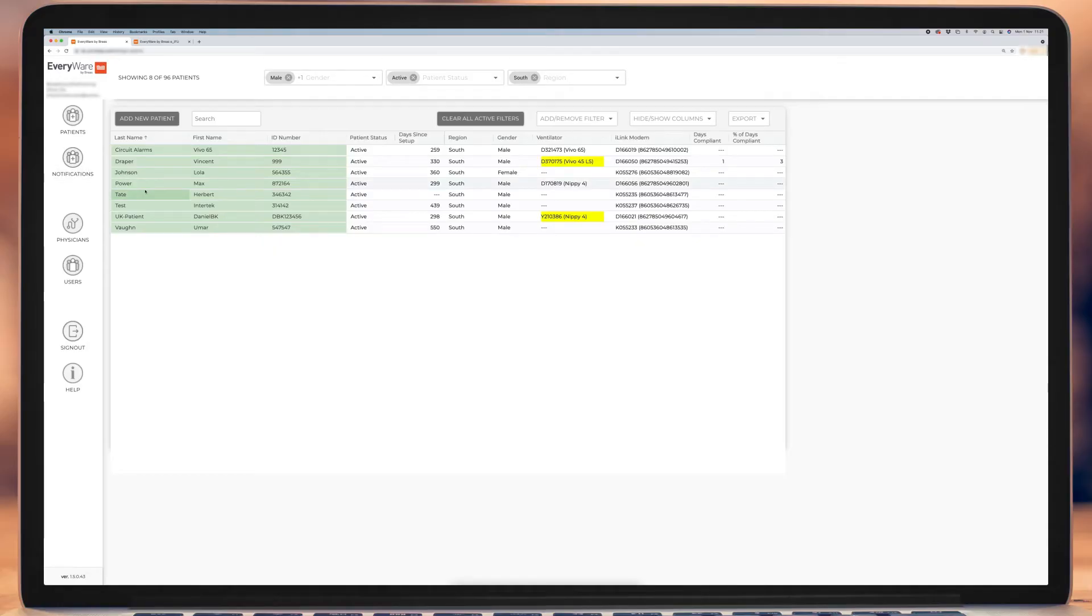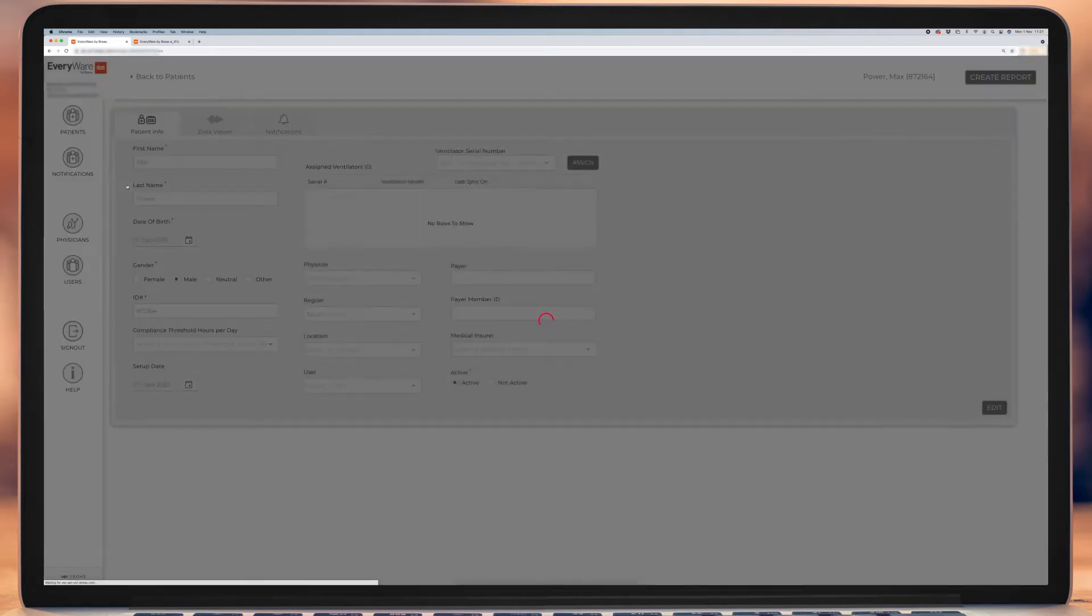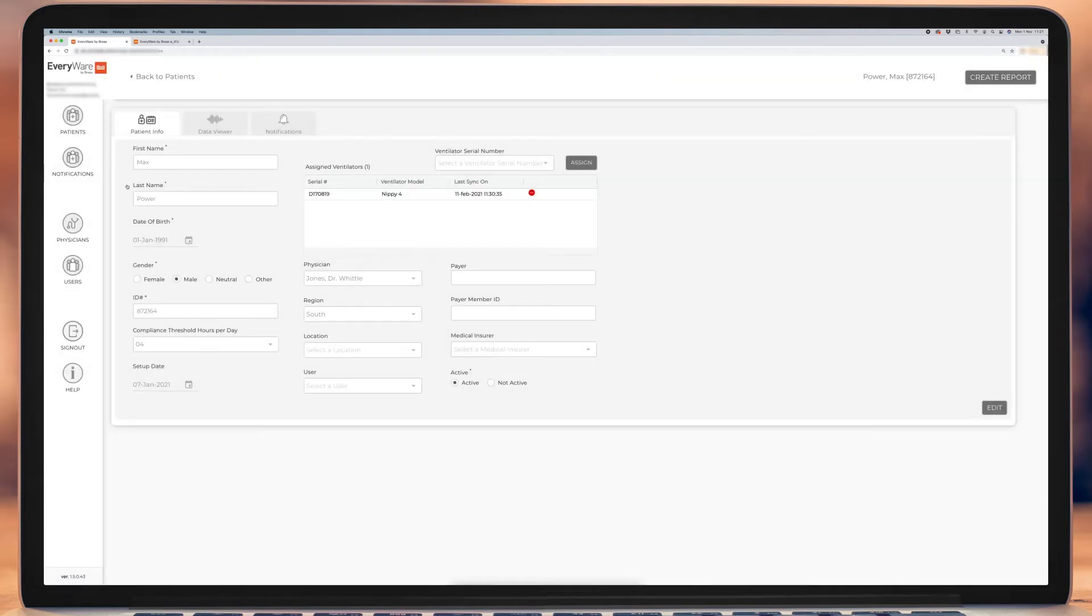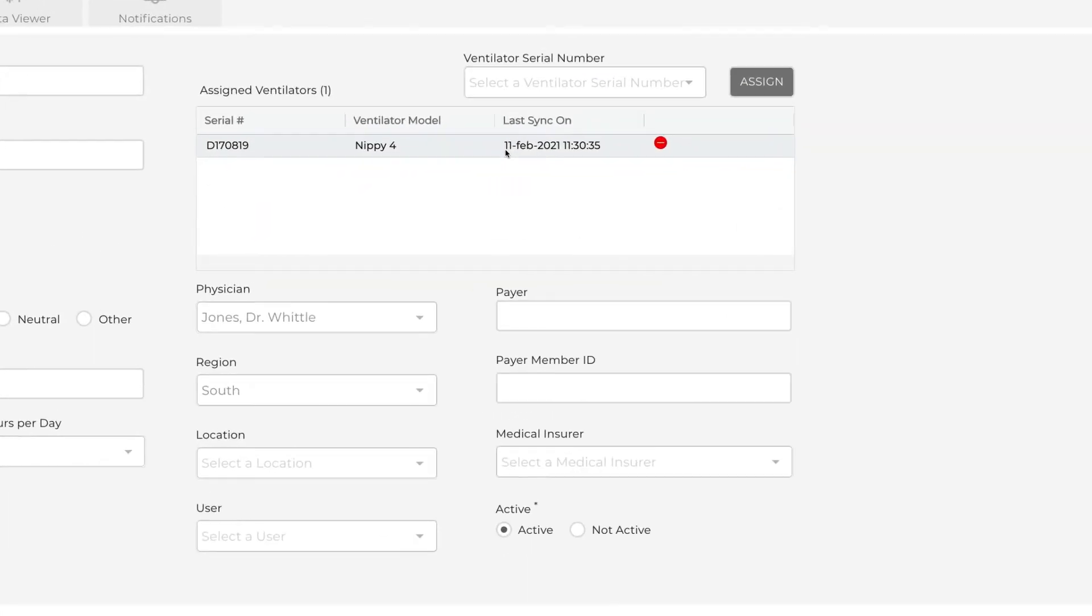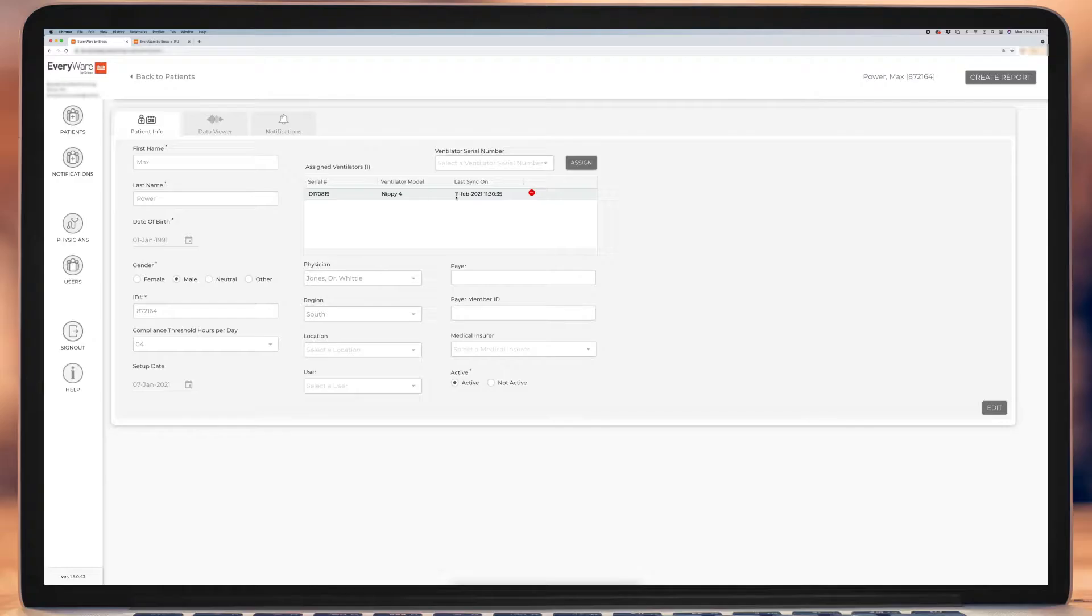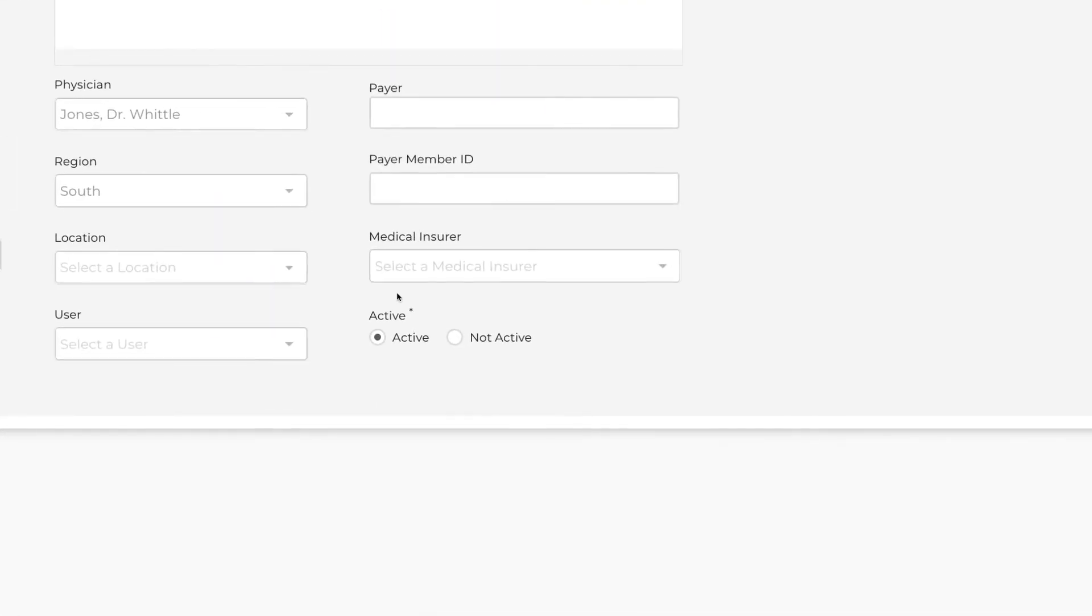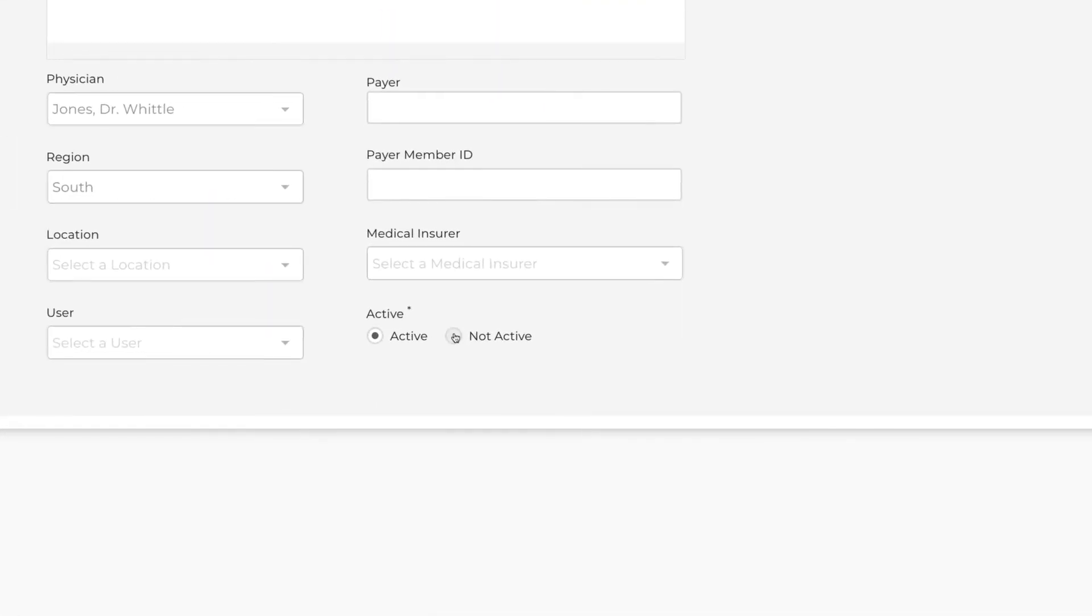In order for data to be sent to a patient record, Everywhere needs to know which patient the data being sent is for. Within the patient record, please check the ventilator assignment window to ensure the correct ventilator serial number is added. The last sync date and time indicates any previous communication which may also be helpful. Check the patient status is set to active and the setup date is correct.